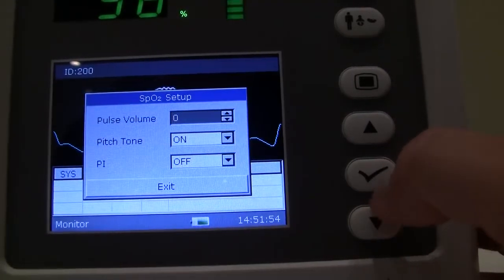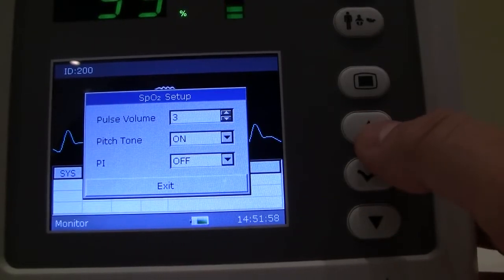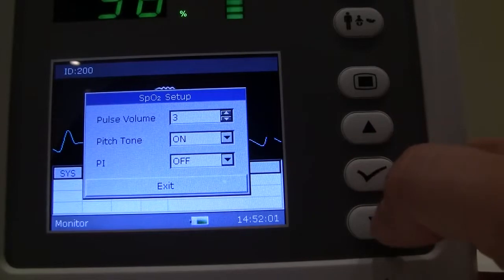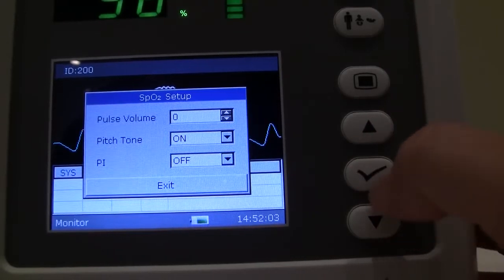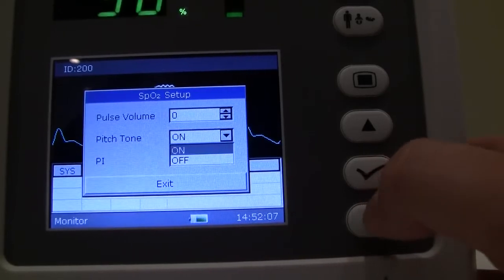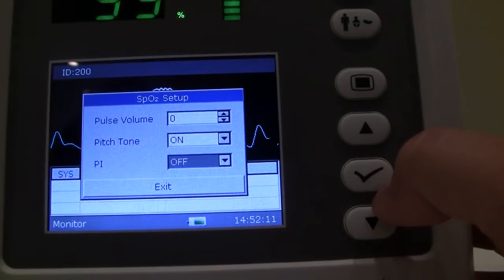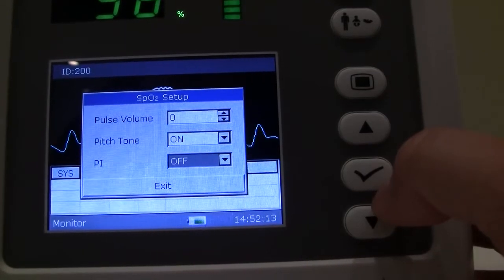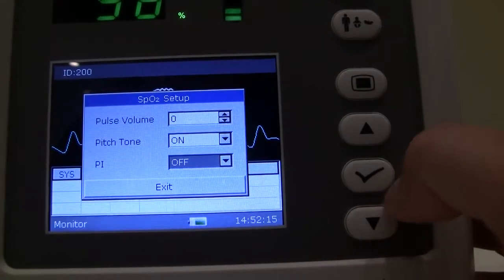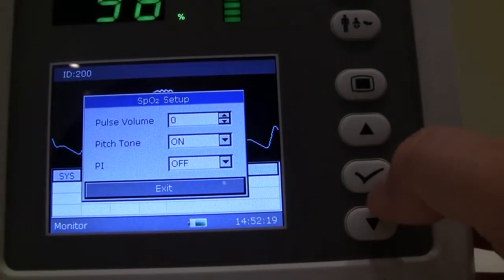SpO2 setup. Pulse volume I have turned down to 0. If we turn that up, obviously you can hear it. I'll turn that back down so that it doesn't interfere with the video. Pitch tone, on or off. Most people like to have that on so that if pulse rate and SpO2 levels are going up, the pitch tone will actually increase the tone, and if they drop, it'll go to a lower tone.